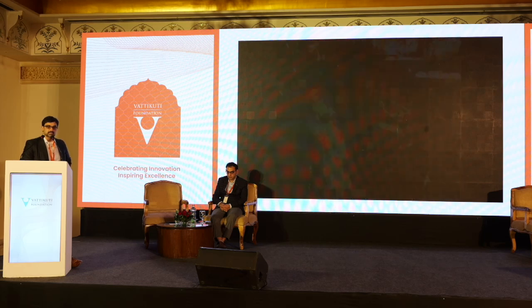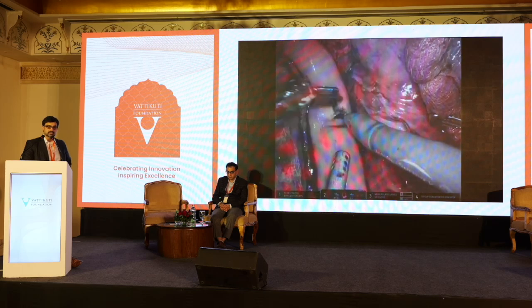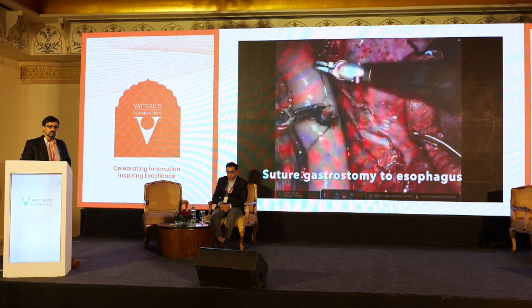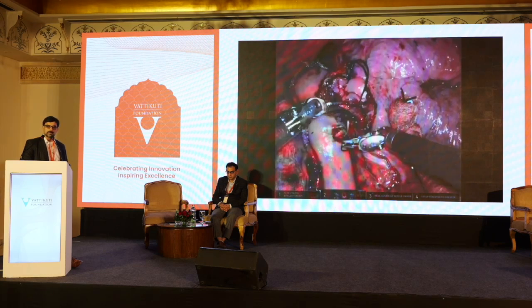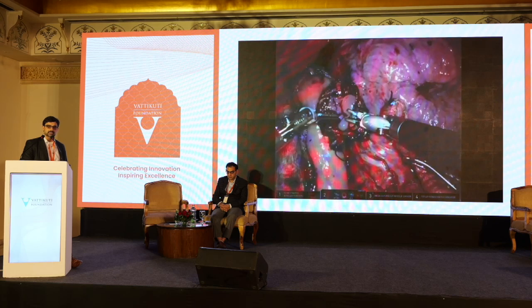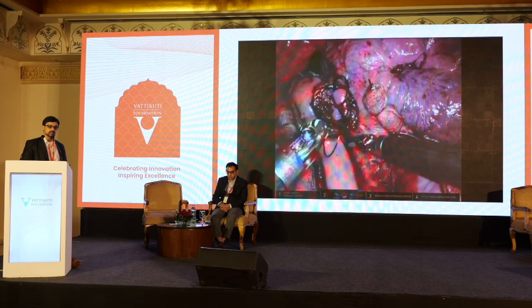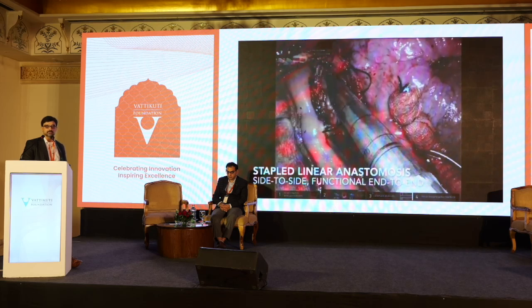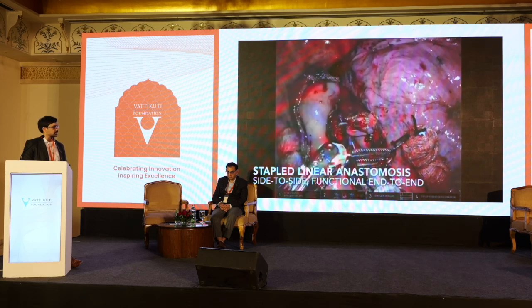We place a retraction suture. I use ICG to find the optimum site for the anastomosis, and then make a gastrotomy. We just do a holding suture right here at the 6 o'clock position. And then we'll proceed with the stapled anastomosis. It's a side-to-side functional end-to-end.